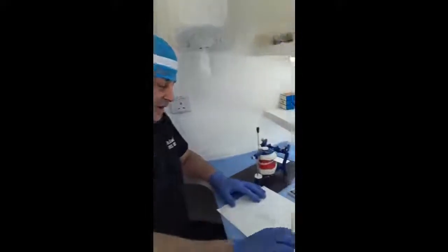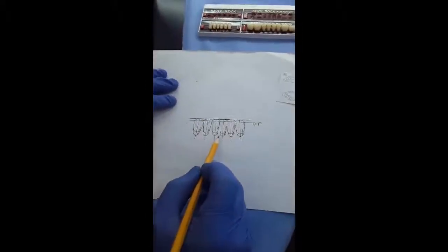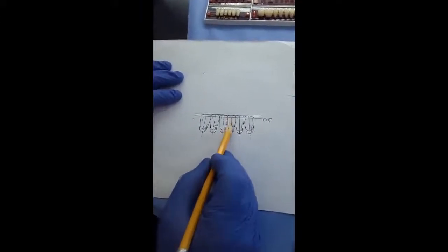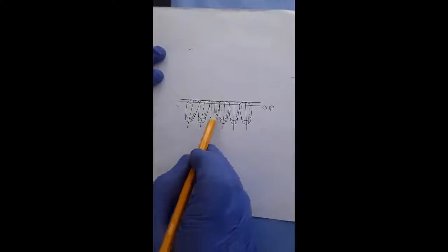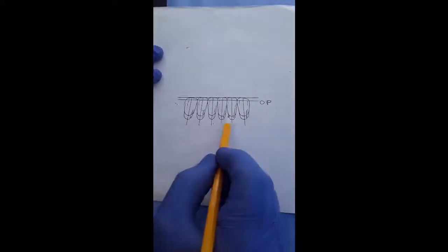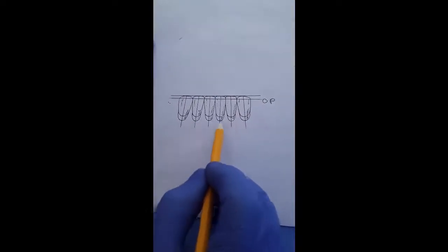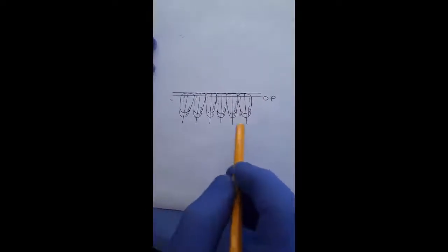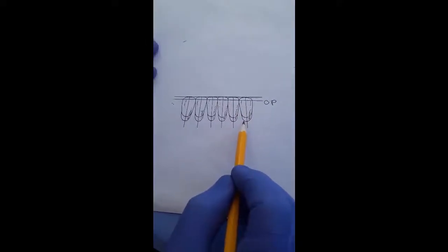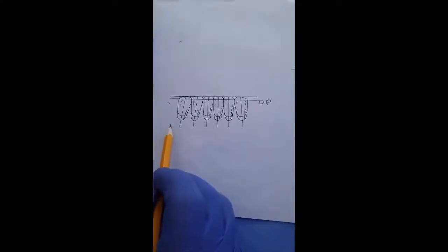Now, here we can observe the labial view of the lower anteriors. These, the two centrals, you can see that the long axis will be perpendicular to the occlusal plane. For the lateral incisors, the long axis will move distally at the neck area slightly, while for the canines, the long axis will move more distally at the cervical area.